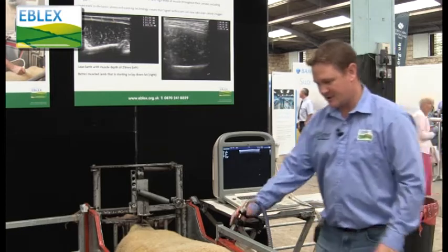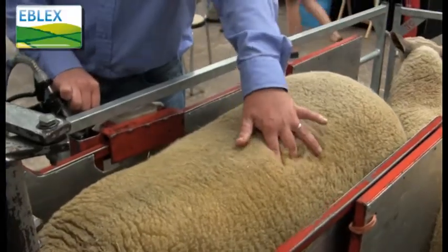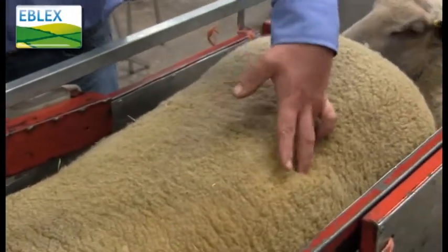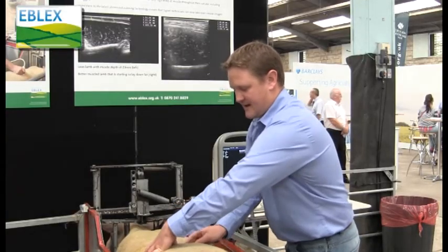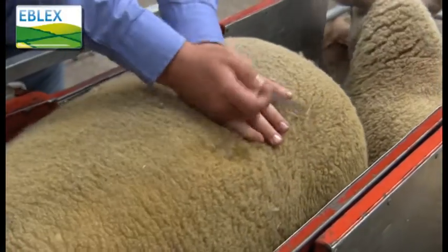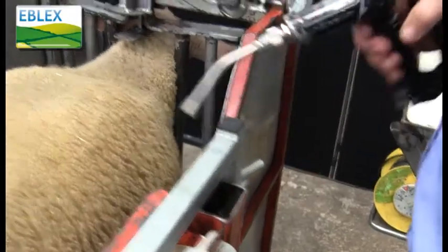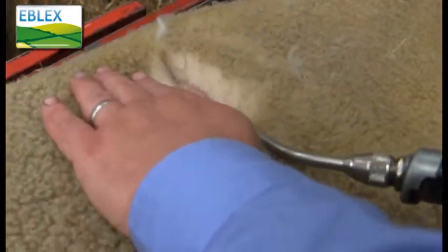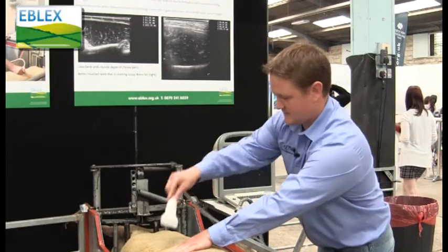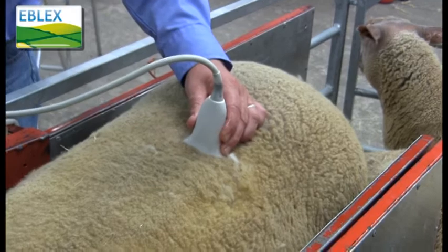The scanning process is quite a simple one. We find the third transverse process of the lamb, insert a pen to separate the wool, make a parting, and use a little bit of liquid paraffin to get good contact on the skin and then apply the ultrasound head.